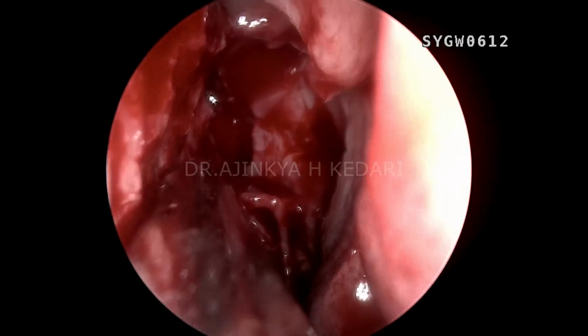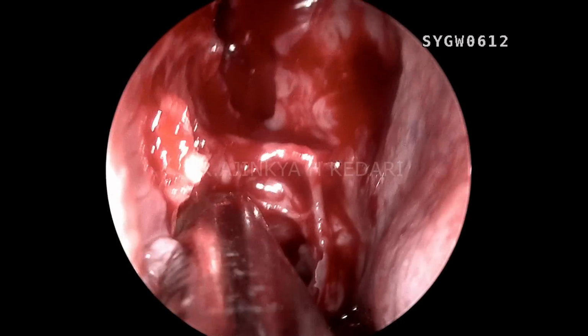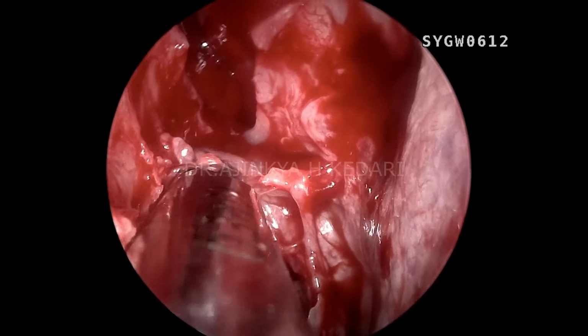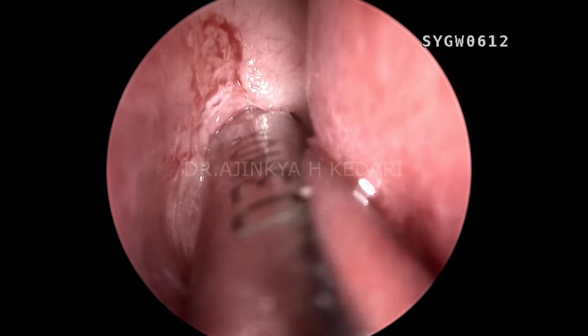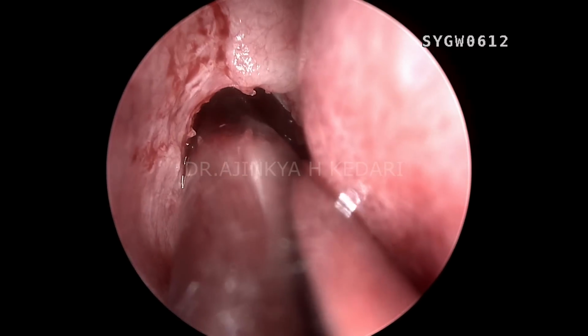You can see the glimpse of the lamina papyracea right now. My debrider is against the lamina papyracea. You can see that moving. That's the lamina papyracea, thinned out lamina papyracea. I'm just taking away the anterior and the posterior ethmoids. So you can see with the debrider, I'm back again at the axillary level.